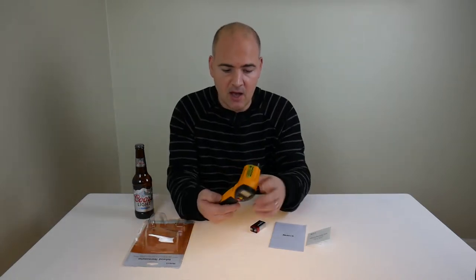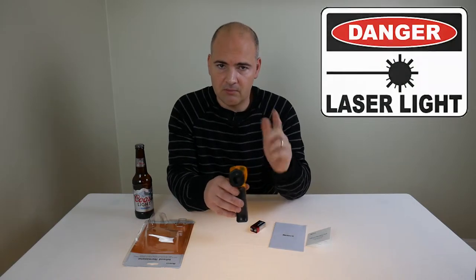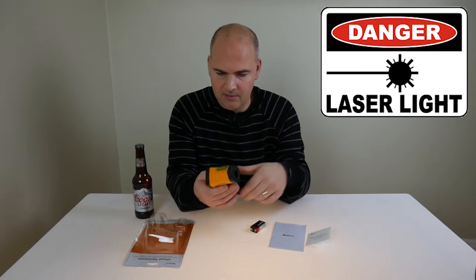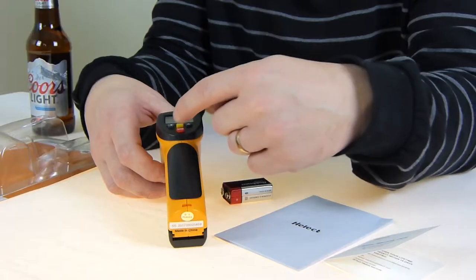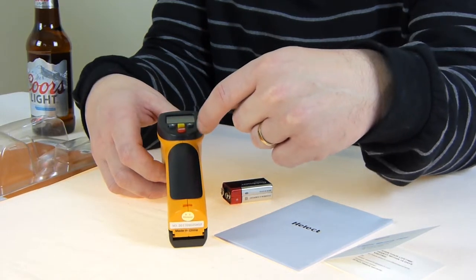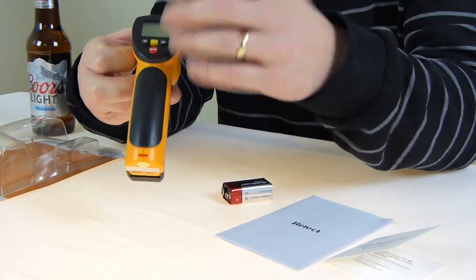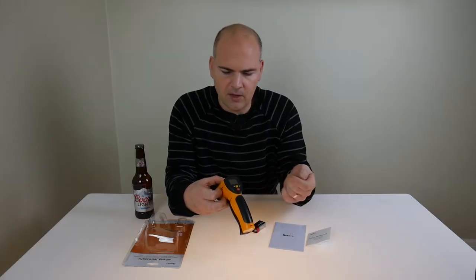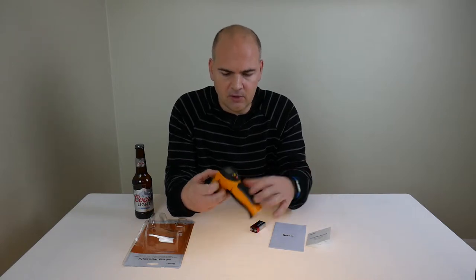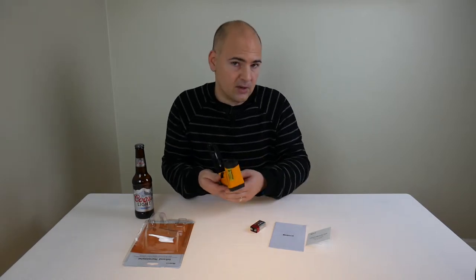There is the thermometer. At the front is the laser end — obviously, when that's on, don't look at it, very bad for you. On the back, you've got different controls for temperature readings. There's a yellow button which changes between centigrade and Fahrenheit. So if you're in the US, you want Fahrenheit; if you're in the UK or Europe, you want centigrade. You can use either — it's not a problem. Let's put the battery in and see what it does.